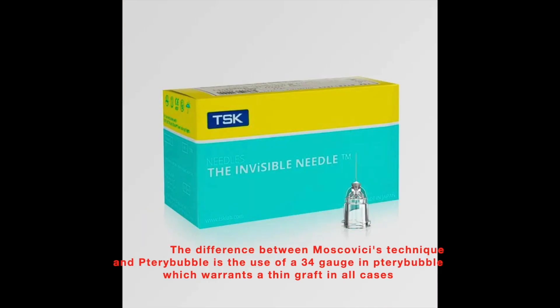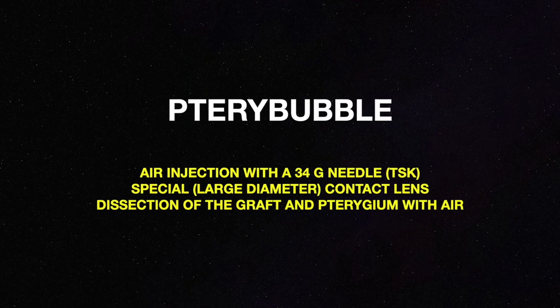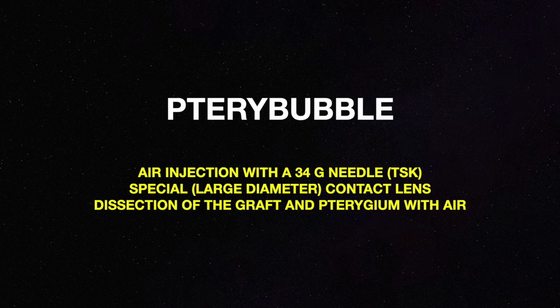Pterybubble differs from Moscovici's technique by using a 34-gauge needle, ensuring a thin graft in all cases. The Pterybubble technique consists of air injection with a TSK needle, dissection, and placement of a special contact lens.